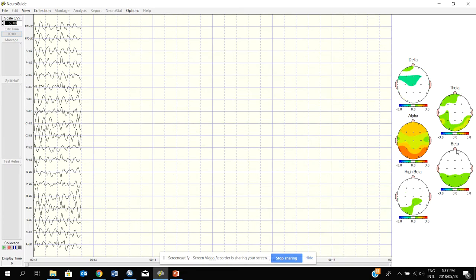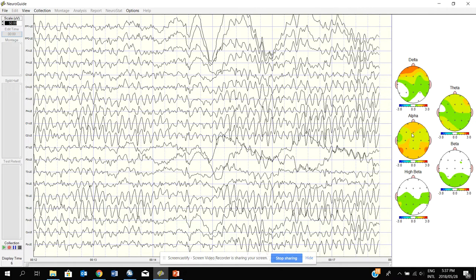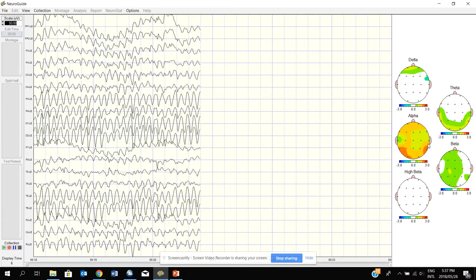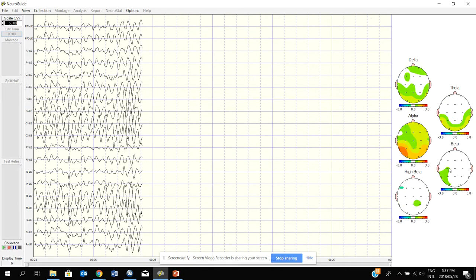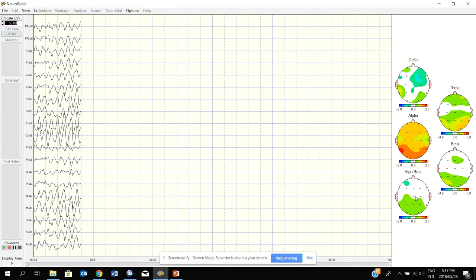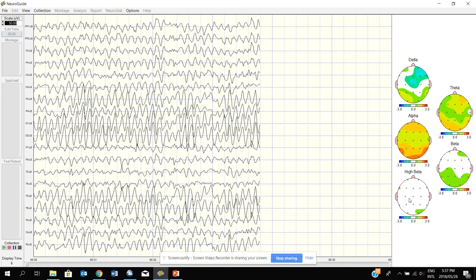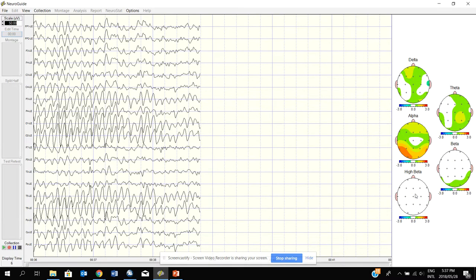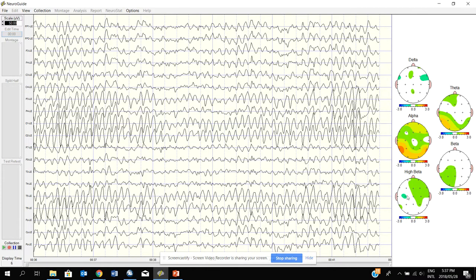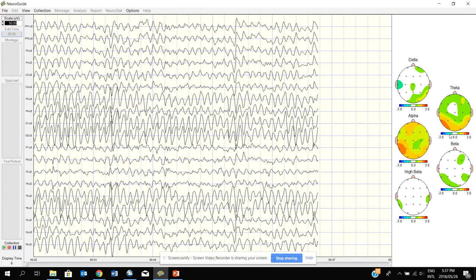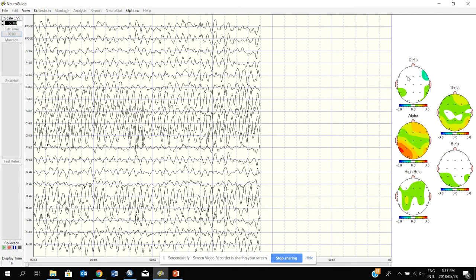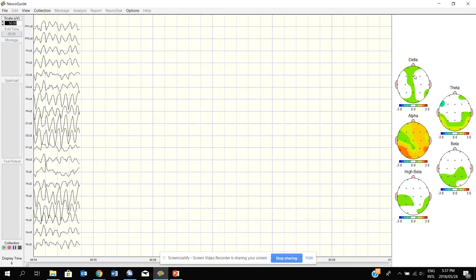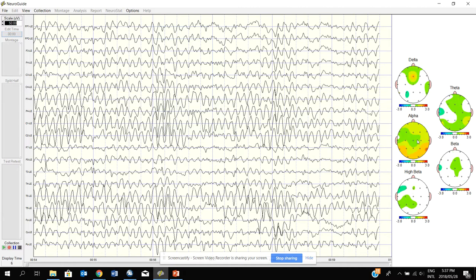So in terms of tension and relaxation, if we use alpha as our reference point, if a person has got more and more and more of these, the beta range, that is beta and high beta, there is more tension there. There might actually be even more anxiety, especially towards high beta, more rumination, over aroused, an over aroused brain, which is associated with a lot of tense feelings and anxiety. If we move from alpha going towards delta, going back to the slowest waves, then we are getting more restfulness in some sense, but slowness of brain waves.